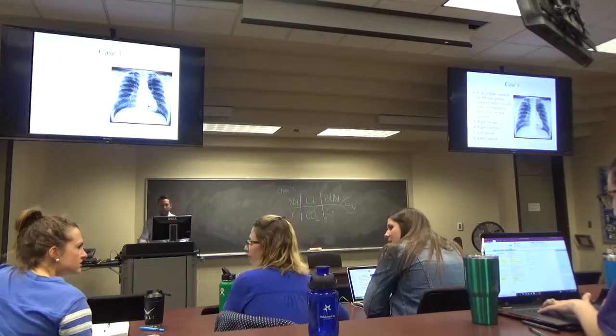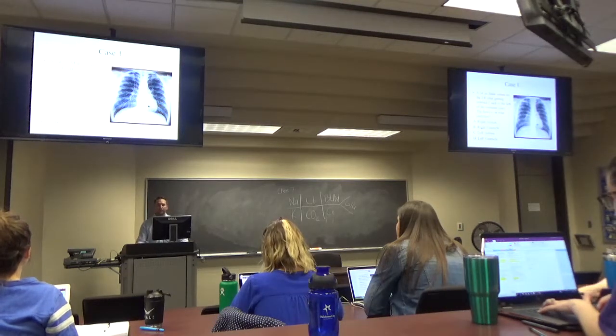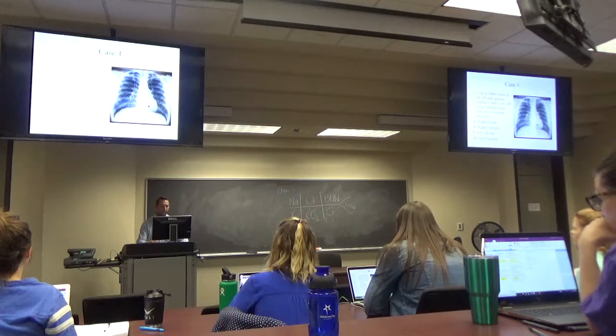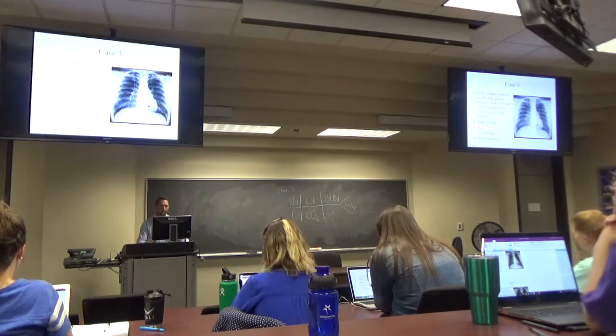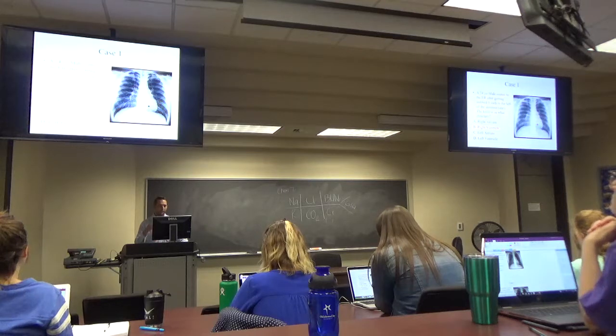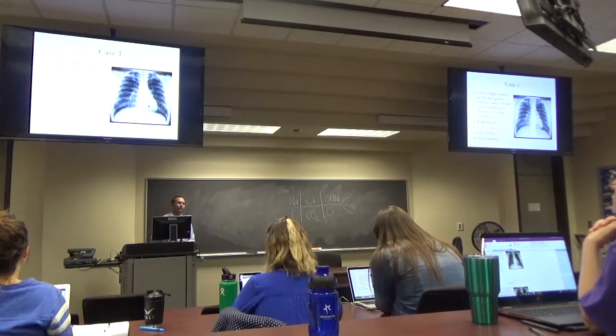Alright, so this is actually a classic anatomy board question that I was asked in one of my boards. It's actually the right ventricle, and I'll show you exactly why, just like the anatomy of it. Because once you understand the axial anatomy, I think you'll be able to look at a chest X-ray a little bit easier.